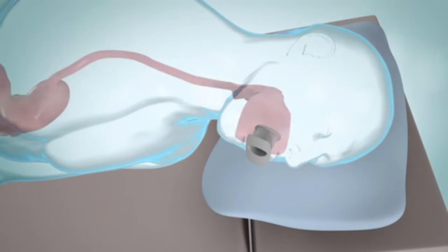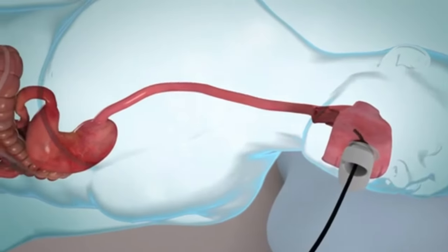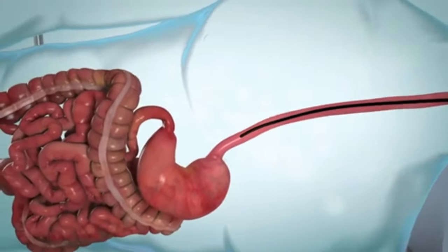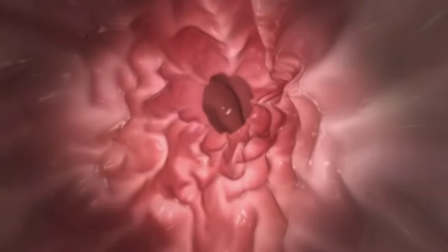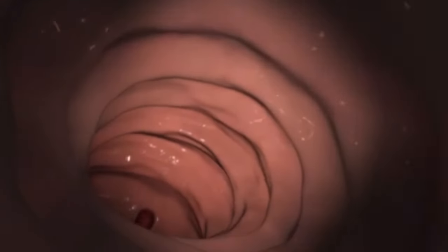During the test, you lie on your left side, and the endoscope is placed in your mouth and moves down your throat. Air is used to expand the GI tract so your provider can see the lining more clearly. You may feel some pressure or discomfort from the air. The scope sends pictures of the GI tract to a video screen, and your provider looks at your esophagus, stomach, and duodenum for problems such as bleeding, inflammation, or growths.